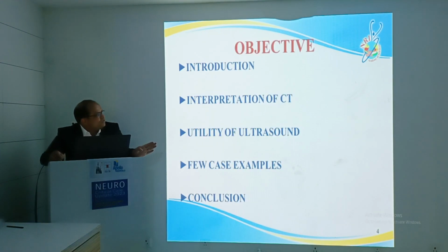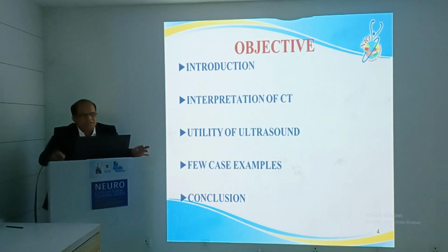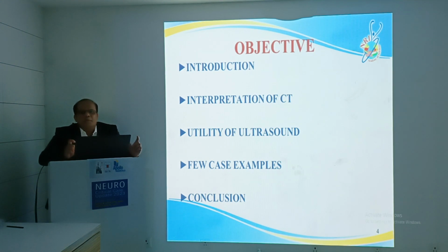So we'll go through this topic in the following subheadings: introduction, and then the interpretation of the CT scan. We'll conclude this session by going through a few case examples, because in this span of 20 minutes we cannot go into the depth of other imaging techniques like MRI.